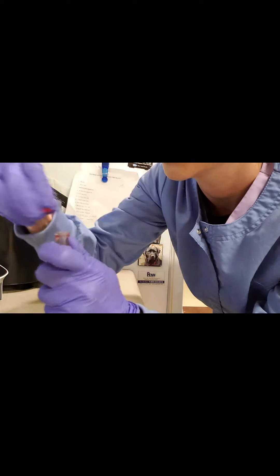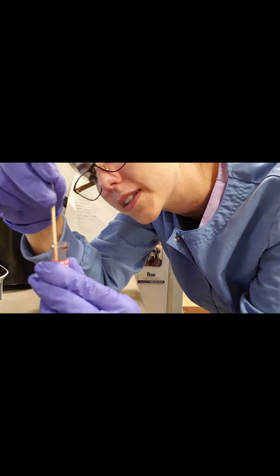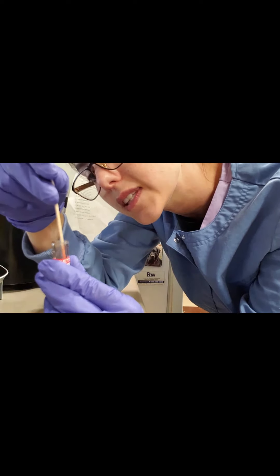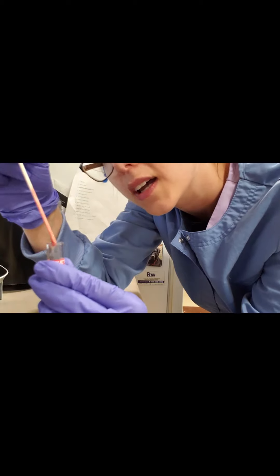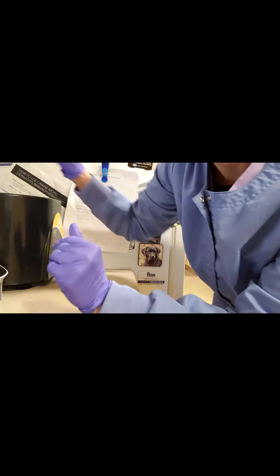And then our last one, our red top tube — our serum separator. This one didn't have as many clots. We'll put that into our centrifuge.